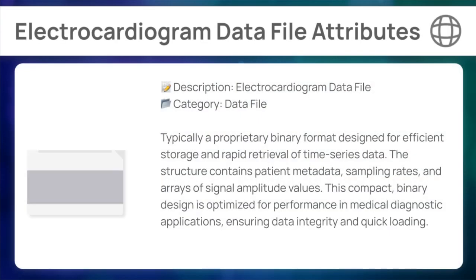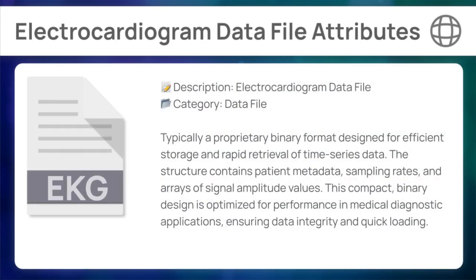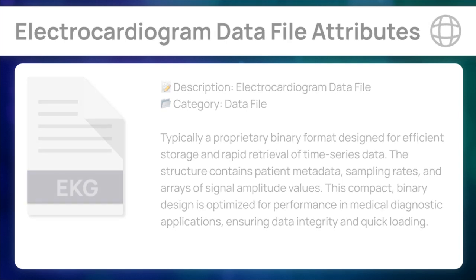It's typically a proprietary binary format designed for efficient storage and rapid retrieval of time series data. The structure contains patient metadata, sampling rates, and arrays of signal amplitude values. This compact binary design is optimized for performance in medical diagnostic applications, ensuring data integrity and quick loading.